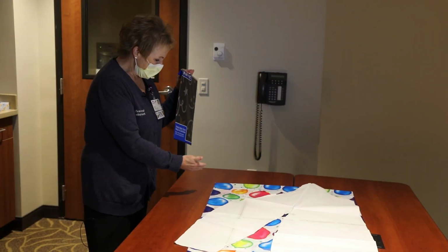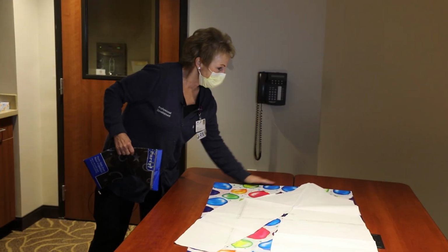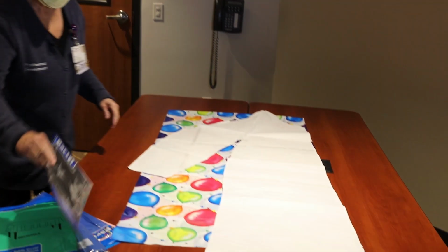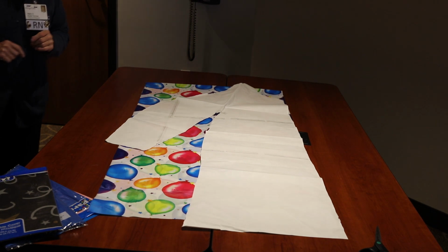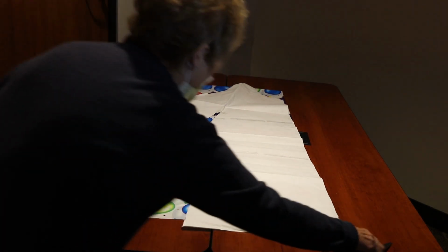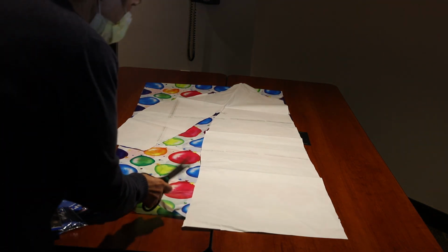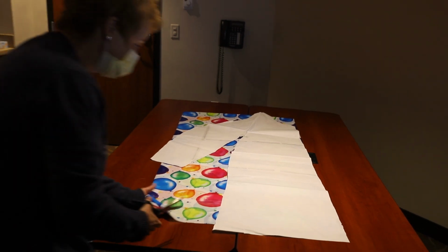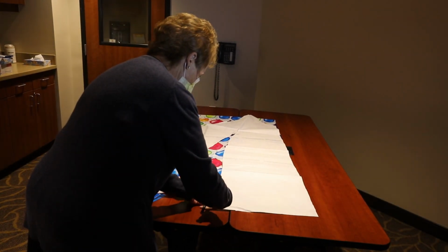We have laid this out with the fold on the top and the fold on the center of the pattern so that when we cut it out, it would be in the right direction. So I'm going to cut this out. The pattern is laid to where the fold is on the fold and the shoulder fold is at the top. And we simply cut this out.